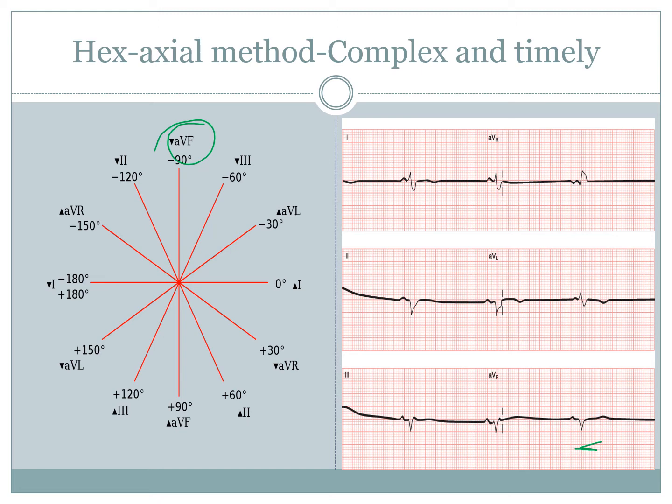Now, to give an example, and then I promise we'll stop talking about it because this is the more complex method. If you have a look at the picture in front of you, and we determine, let's say, aVL is the most equiphasic QRS complex, then if we go 90 degrees from that particular aVL line, you'll have lead 2.